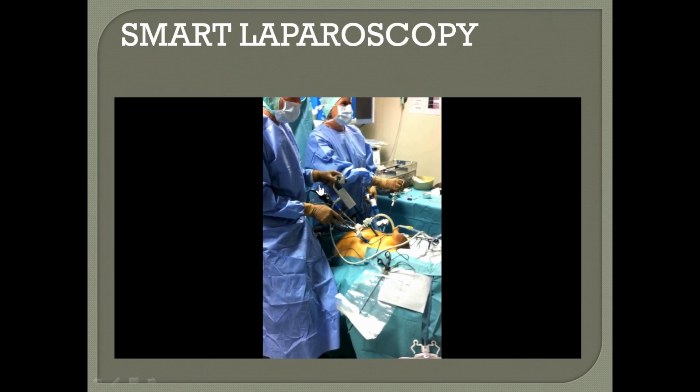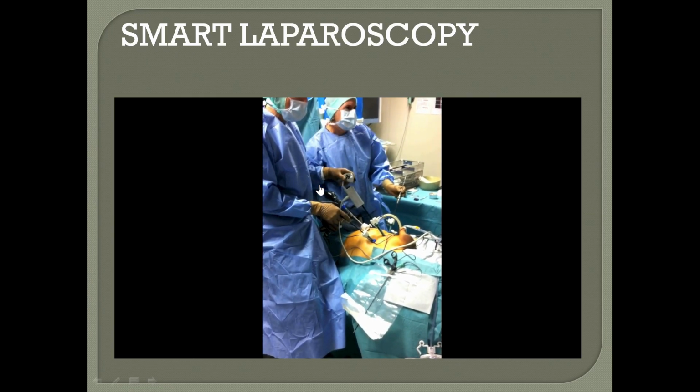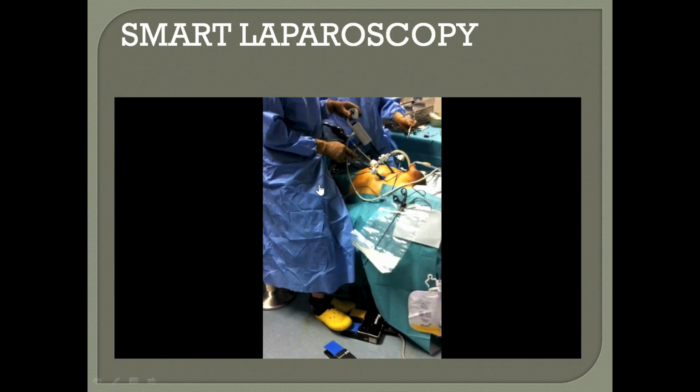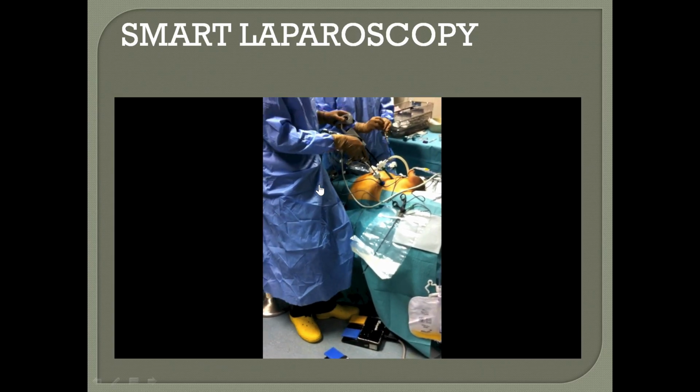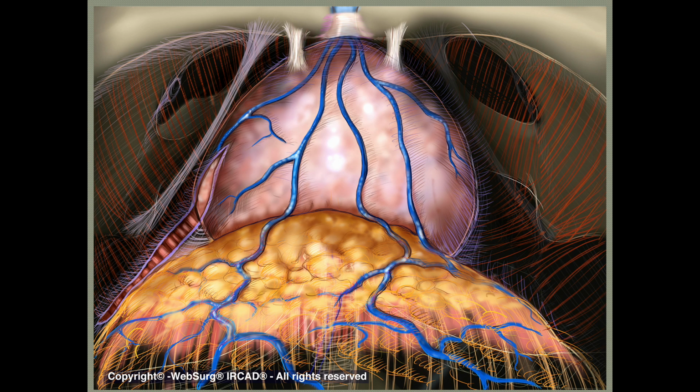And you see it's possible to be comfortable. You look how I'm working. I am on a saddle, and you look at my elbows, look at my hands. I'm totally comfortable. Okay? The 3D vision, mandatory, okay? And now we'll describe the step-by-step procedure.